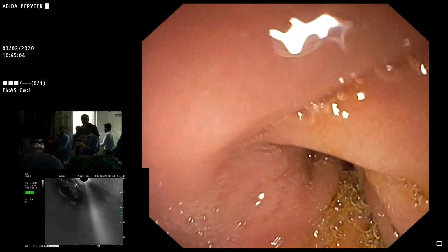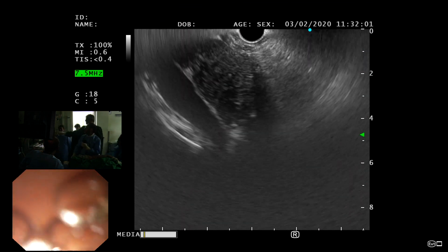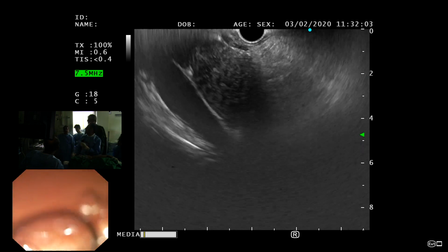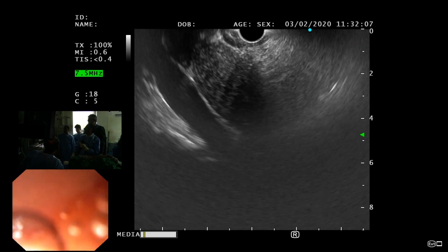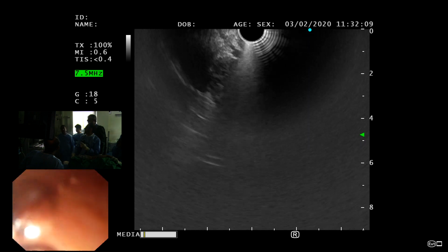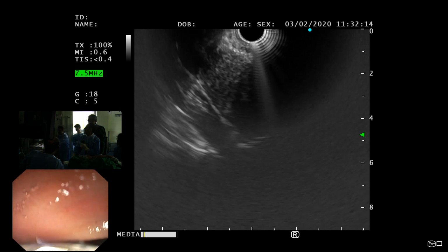Here we are. Yeah, you are in the. So just gentle pull back. Pull back a little bit. Tip up. Tip up. हाँ tip up कर लें अपनी. Tip up. ठीक है. And a little bit anti-clock. लेके आओ. So you've got pancreas there. थोड़ा सा let go of your big wheel. Just tip down करें. Just a little bit. एयर निकाल दो. एयर है यहाँ पे.